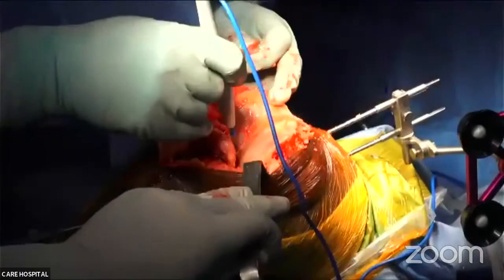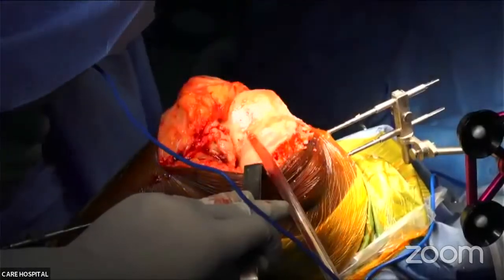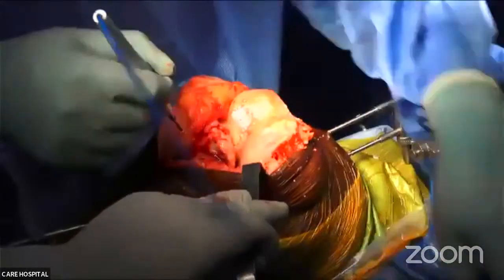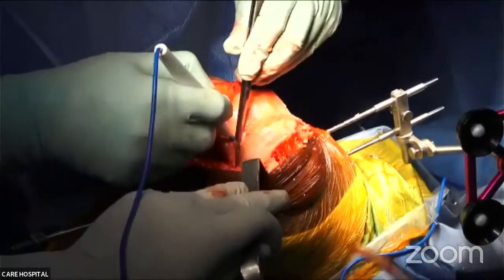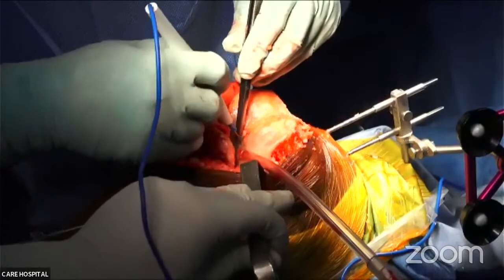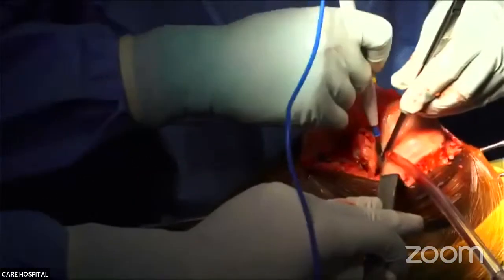So I'll just clear the notch. That's it. Forceps. Whatever you do, there is real time feedback. This is a new technology and everybody is on it. Some people will say removal of osteophytes causes imbalance.